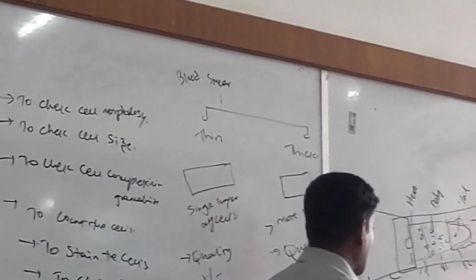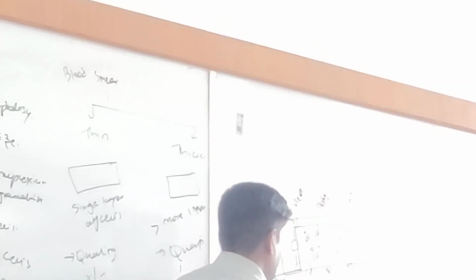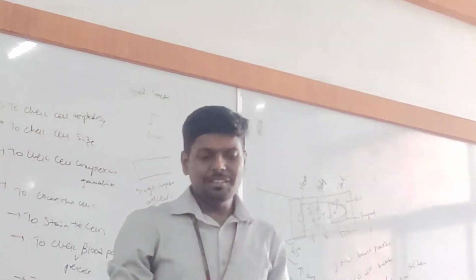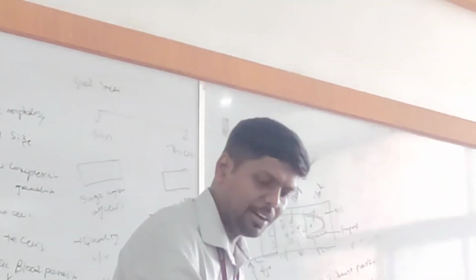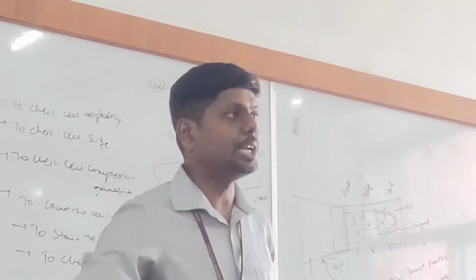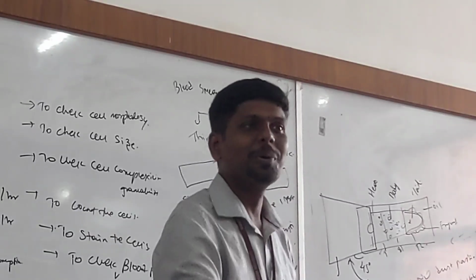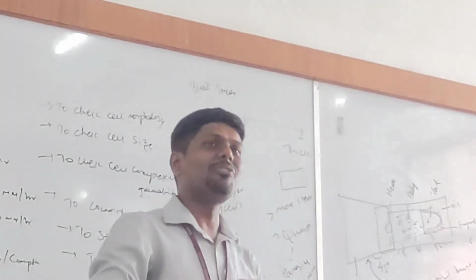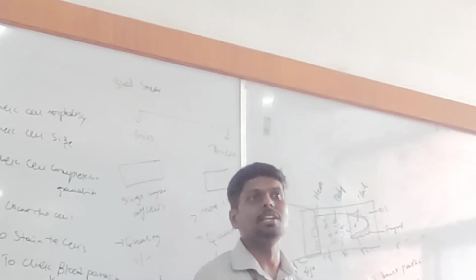The higher the angle, the thicker the smear. This is the rule. The higher the angle, it is directly proportional to the thickness of the smear. Imagine there is water here and I used a duster, touched the water and did like this, vertically. Most of the water will be spread very thinly. If I use a slant, a mop, the mop will be at an angle and will spread over an even larger area. That means it became a thick spread. Ideally the angle should be 45 degrees.